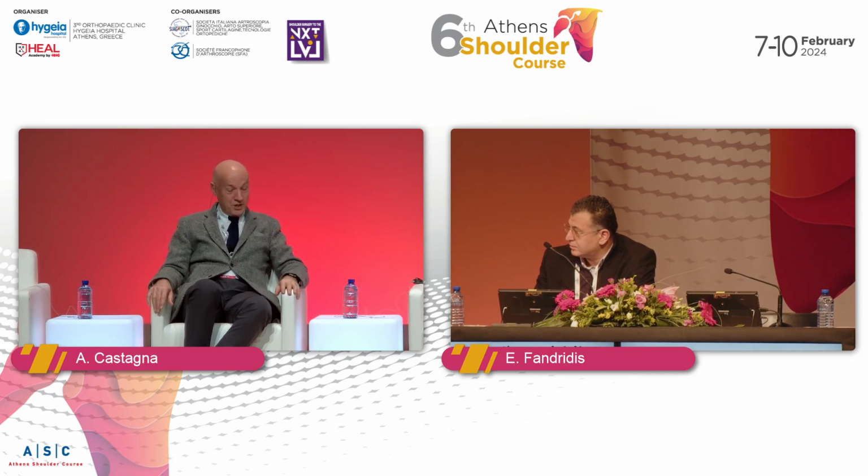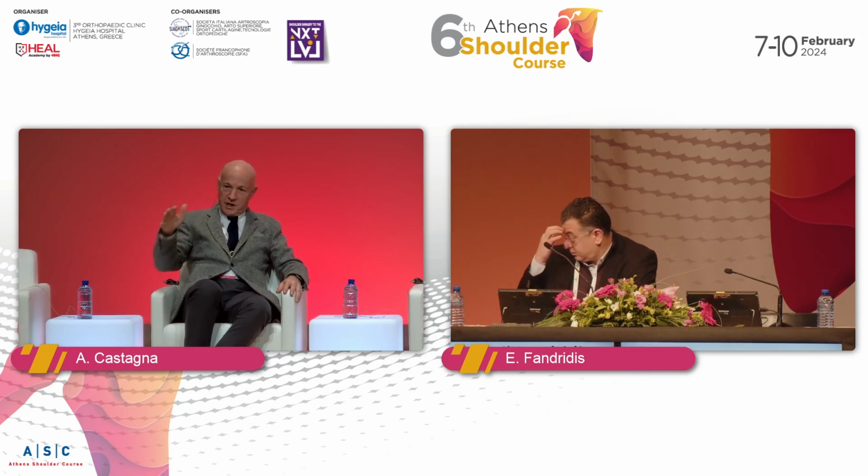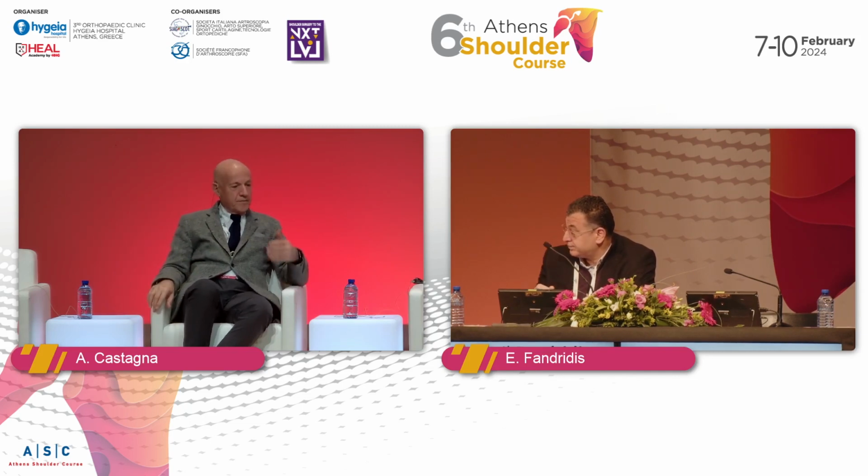And very soon, not tomorrow, but soon, we will be certified by the Ministry of Health to 3D print, let's assume, a fracture plate for the clavicle. We make the CT scan, 3D print, and we can develop the plate, already approved for implant. As soon as this becomes, not tomorrow again, more affordable in terms of money, most of the dedicated systems, adaptability, and so on, will become, not for my generation, but for the future generation, a custom-made design.